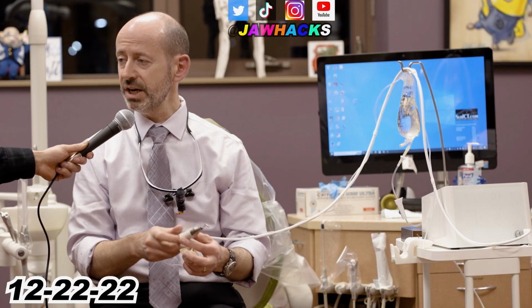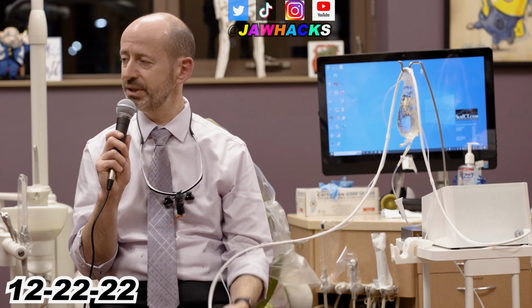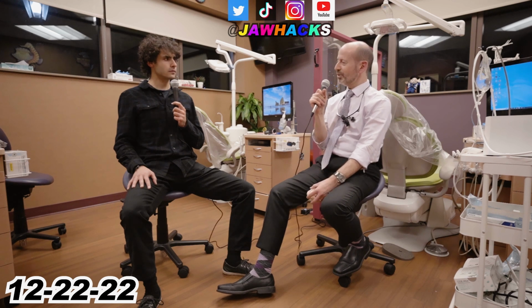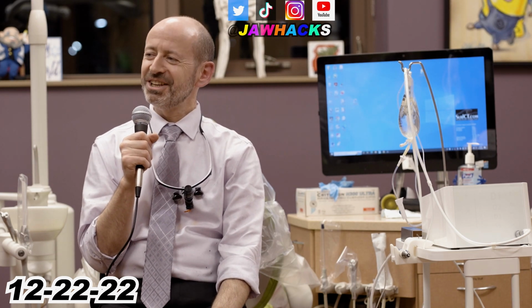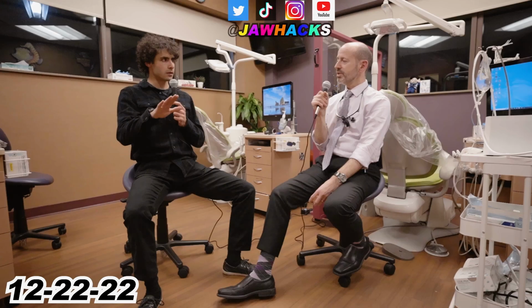And with the proper design and with the proper planning, the issue of splitting is no longer an issue. The recovery is uneventful. If someone's thinking that it's a scary procedure, and I thought so initially too, until I saw a dome procedure done when the surgeon took a chisel and started whacking it into the patient's head. Which is a lot more invasive. Right. So you do go right through the skin. Is there any bleeding? There's no bleeding.